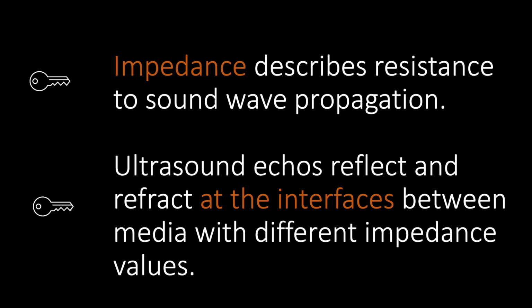And the impedance values, while you don't need to necessarily know them, you should know that general rule that certain tissues pass sound waves more easily, things like hollow fluids. And we'll revisit this in our next section. And then remember that ultrasound echoes reflect and refract at the interfaces between the media with different impedance values. So this is a summary of what we already discussed on the previous slide, but it's super, super important to understand where those echoes are being generated and why, so that we can understand then when things go wrong or when things go into an artifact, how we interpret that artifact to make a diagnostic image for our patients.